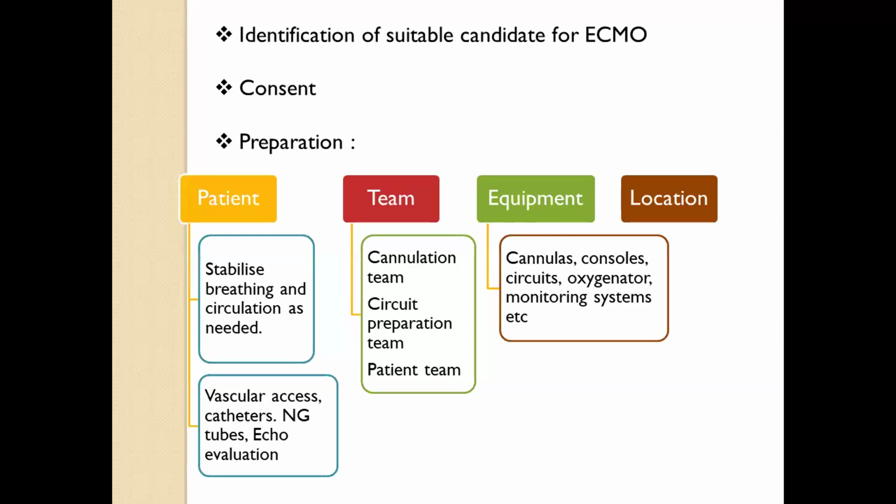So in terms of that preparation, we have to have a good patient preparation, where there is a team which is stabilizing the patient while the process of initiation is going on, stabilizing the breathing and circulation as needed, titrating the ventilation, titrating the vasoactive medication, ensuring that we have enough vascular access, anything that needs to be put in like arterial lines, central lines, an NG tube, urine catheter. All that needs to be done before we initiate, because once we go on heparin, these things become very complicated and the risk of bleeding is very, very high.